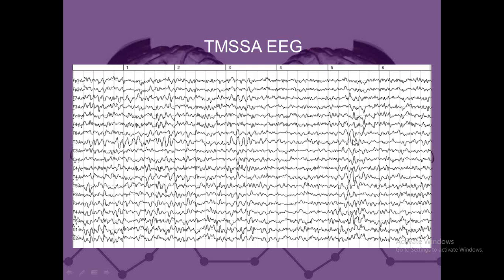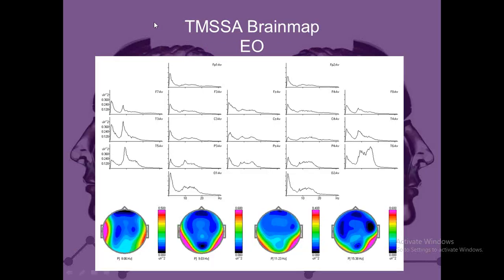It's not that impressive. However, what this turned out to be, I got a call from the doctor. You can see on the maps how it really stands out here on the left temporal lobe, when we did the maps on it.